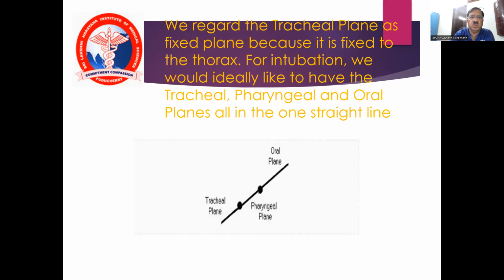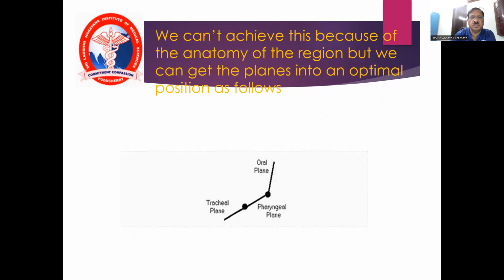For intubation, we would ideally like to have the tracheal, pharyngeal, and oral planes all in one straight line.